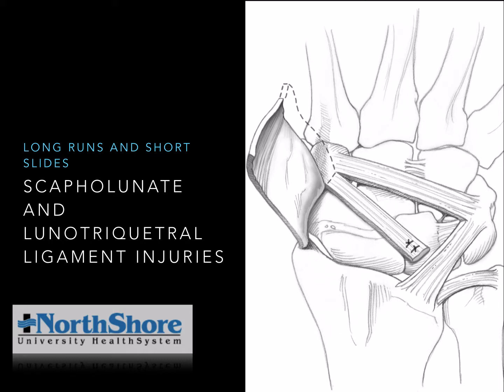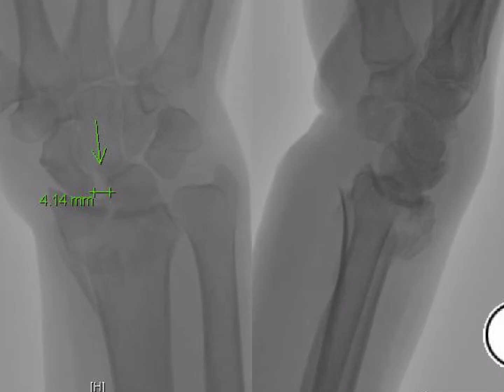So scapholunate and lunotriquetral ligament injuries are often found on MRI, but in my practice, if you need the MRI to find it out, I'm probably not operating on the patient anyway. The study that indicates surgery for me on those much more than an MRI is an X-ray. I look for a gap, and if I see a gap on the X-ray, then it's something that I think that I need to address.